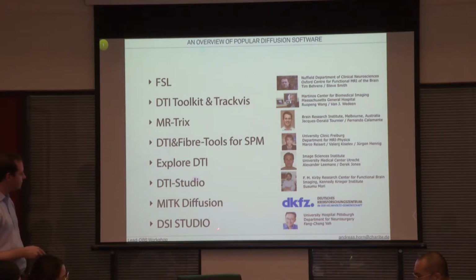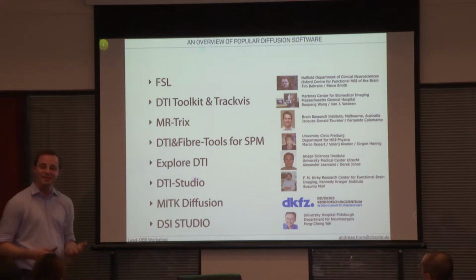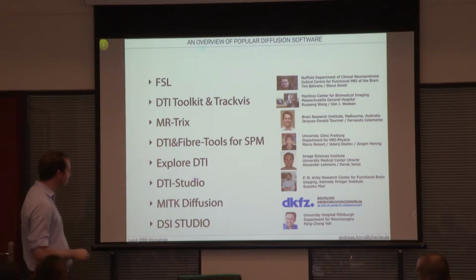And then what I really like, I even think it's the best neuroimaging software ever written. It's called DSI Studio. It's so easy to use, so fast, and beautiful visualizations. So it's good for beginners, but still it's also a great algorithm, I think. By Fang-Cheng Yeh, also great support. He answers emails very well. So I can really recommend this as well.